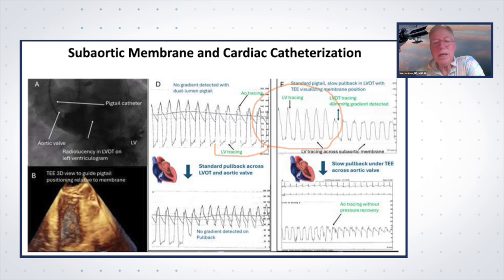And this aortic pressure certainly doesn't look like it's being impacted by any kind of gradient generator. That is, you have a gradient, should you not see some disturbance in the aortic pressure as well? Now, my colleagues can comment, but I'd be curious.